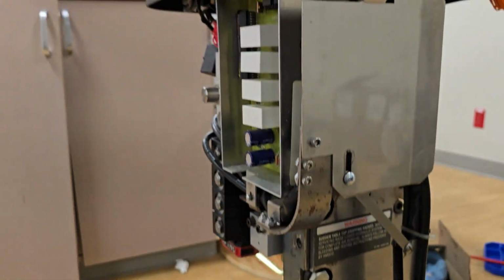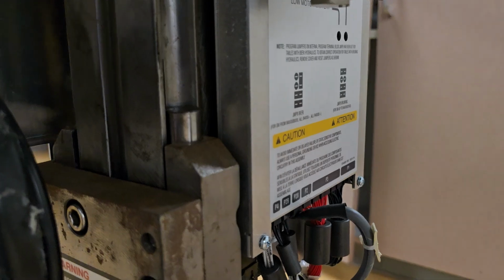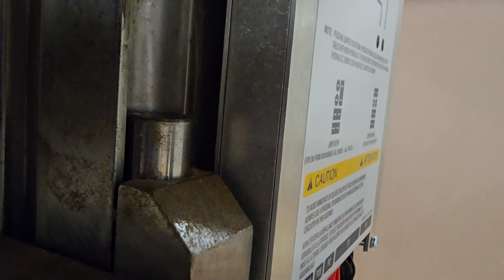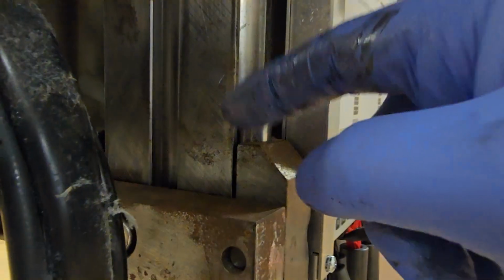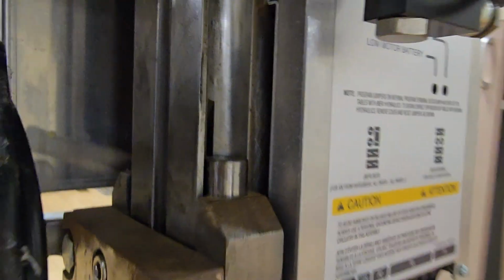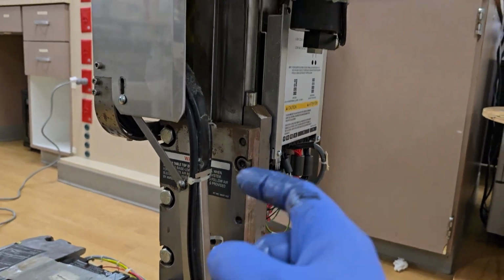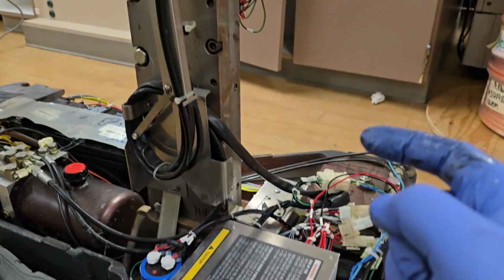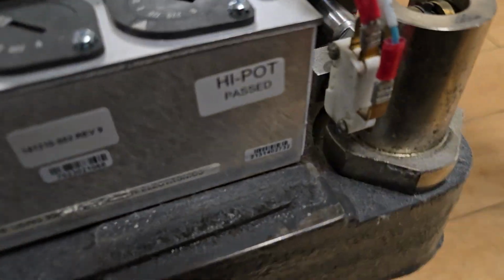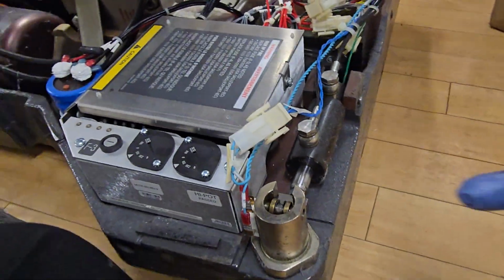You got to make sure that they're tight, and make sure that this one here is actually parallel to that one. So when we currently shake the table, let's see if I can show it. I don't know if you can see it. This rod right here is wiggling in and out of that groove, and that is actually what's causing the problem. So we got to adjust the lash, make sure it's greased, and check out the rest of the table, which also found a cracked micro switch down here, so that guy's got to get changed out as well.